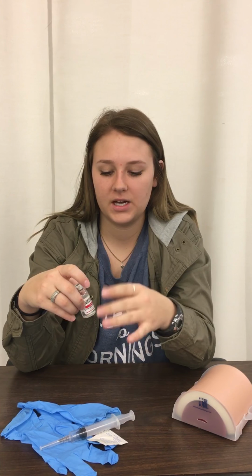And then whenever you are getting the medication out of storage, you're going to want to check the expiration date, and you're going to want to check that it's the right medication, all of that. Okay, so whenever you're getting the medication, you're going to check the doctor's orders. You're going to check for allergies, anything that the patient might have that would react differently to the medication.